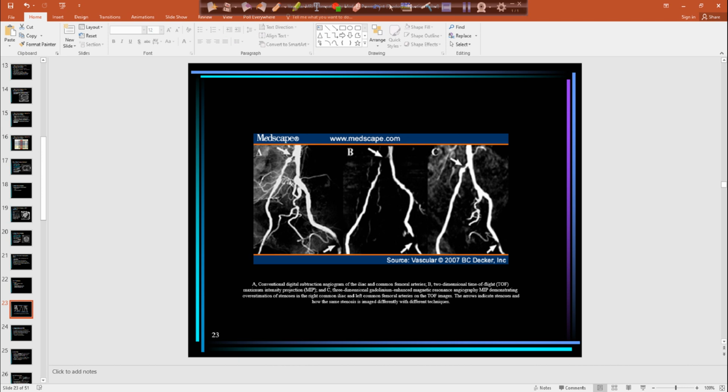Sometimes it subtracts out better, but usually really short T1 tissues that have a short T1 recovery also sometimes appear bright within the background. So it's not always the best way to get the stationary tissues out of the way. Sometimes with these digital subtractions, you also have to omit, meaning you have to cut out all the stationary tissues so that you see the vessels even better.